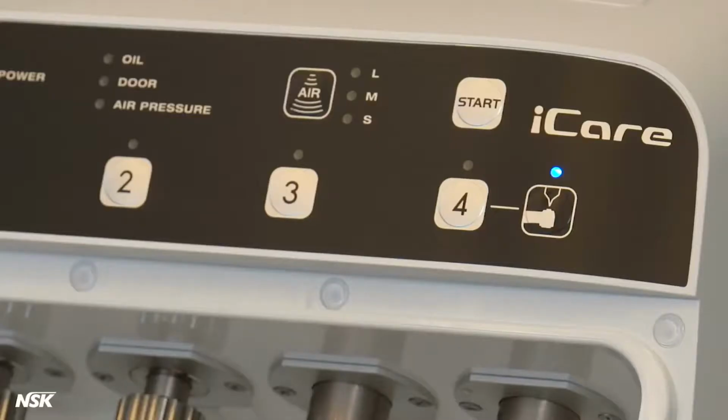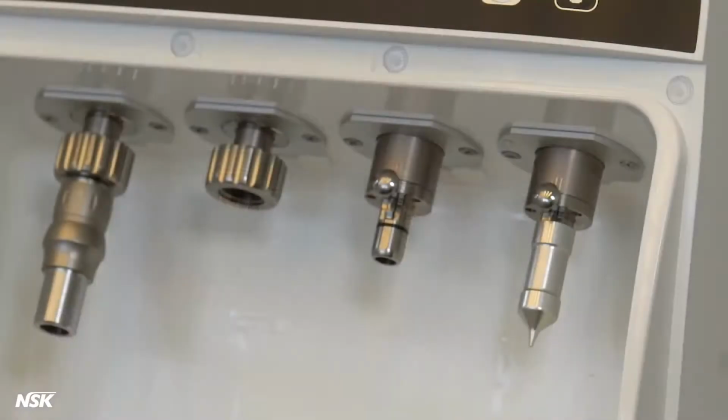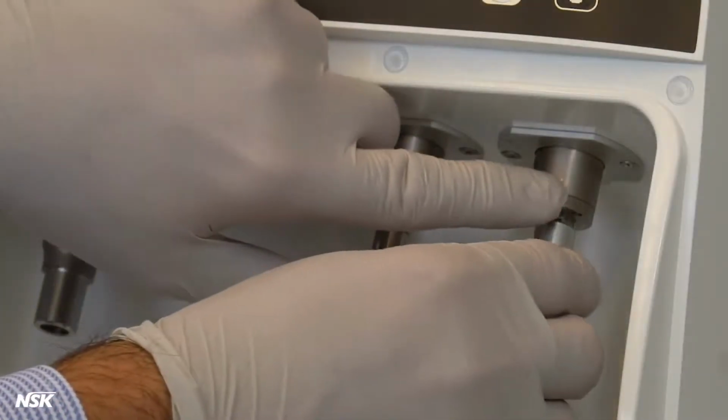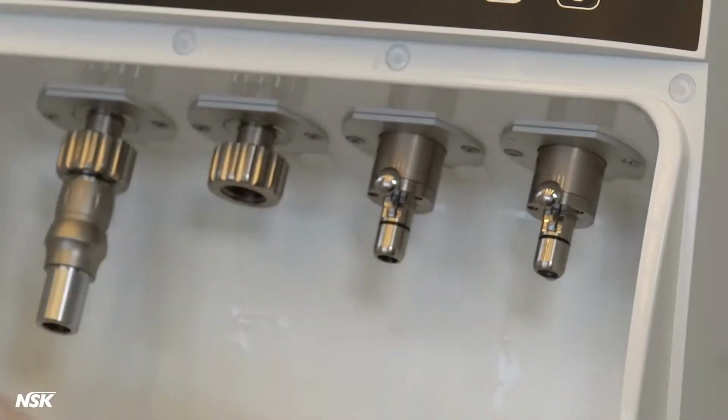The light will blink during the lubricating process. When lubricating is complete, you will hear a short beep and the light will turn off. To remove the chuck cleaning nozzle, push the lock button and pull down the nozzle gently. You can store it in the top compartment for future use.